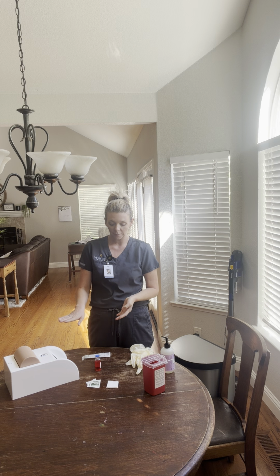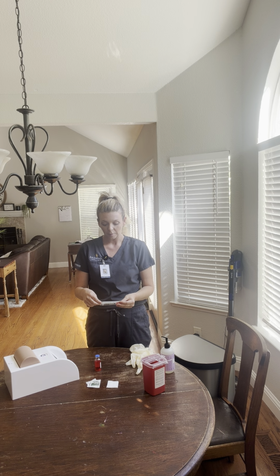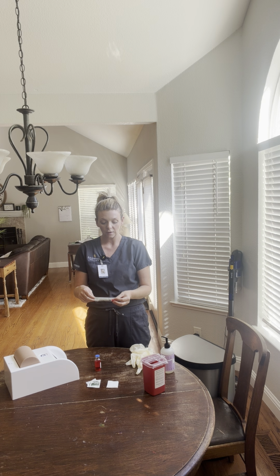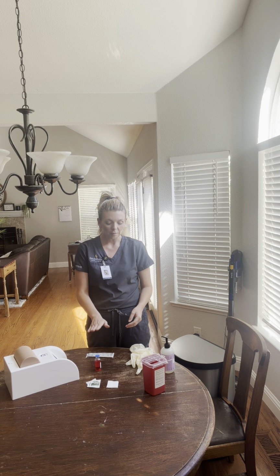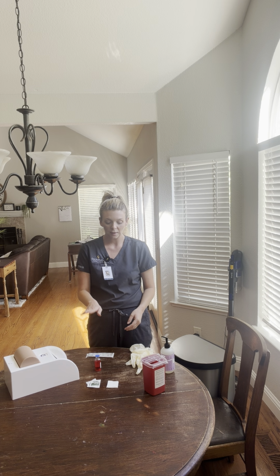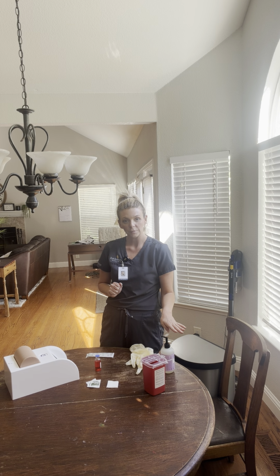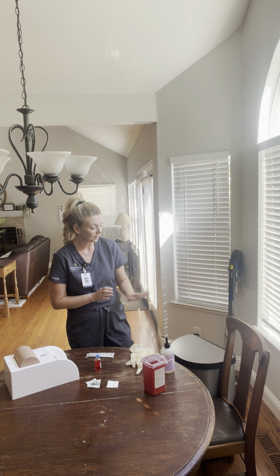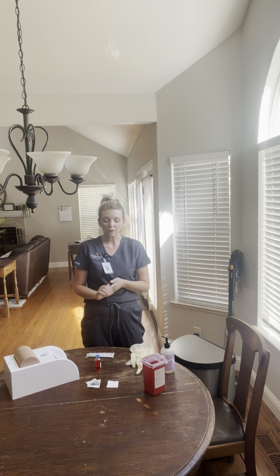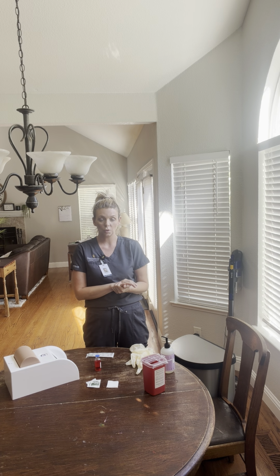I have my patient, I have my medication, I have my 25 gauge 5/8 of an inch needle. That is a 1 milliliter syringe. The medication today is going to be heparin. I have my gloves, hand sanitizer for hand hygiene, my sharps container, alcohol swabs and gauze, and of course my trash can. The first thing that I'm going to do is I'm going to go over the physician's orders.